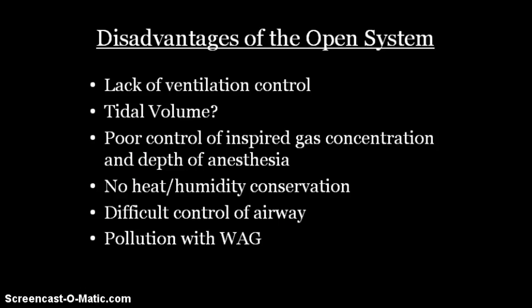However, the disadvantages of this system far exceed the advantages. Its simplicity and lack of components prevent controlled ventilation, assessment of tidal volume, control of gas concentration, and anesthesia depth, as well as placing the patient and members of the surgical team at risk by not conserving heat or humidity and polluting the OR environment.